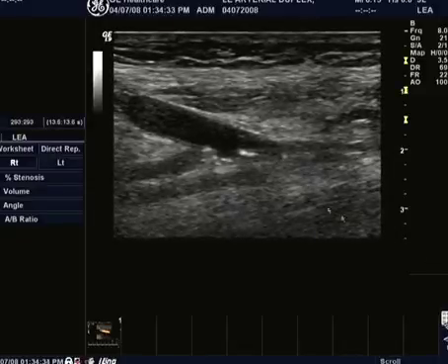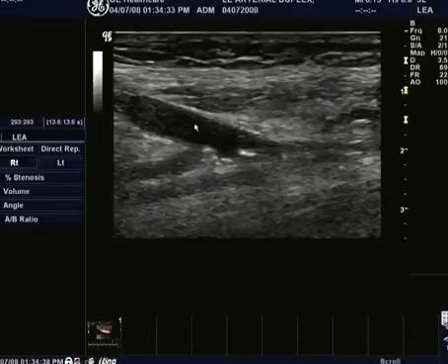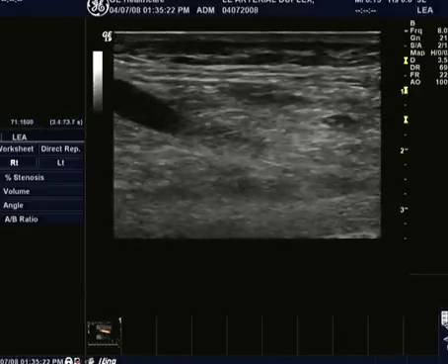Okay, I'm just going to freeze that and again come up here and let's talk through it. Here's the vein, big, beautiful, healthy. Here's the more proximal posterior tib. We'll come down a little bit and get a different view here of the distal posterior tib. It's a little bit out of plane, but what I wanted to show you here is we can see a little bit of stuff right here against the back wall of the artery. That's not uncommon to see. This is probably a little bit of hyperplasia at the anastomosis. That's why we make the anastomosis as wide as we do, so that we can get a little bit of hyperplasia and it still doesn't become flow limiting. That's exactly why we angle it like that. So we see that normal anatomy and can expect a little bit of change here.